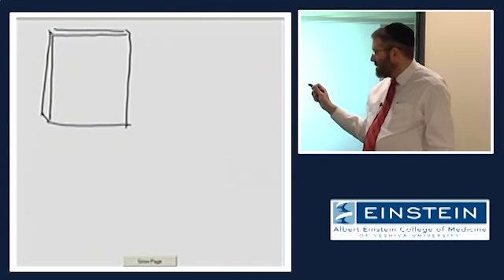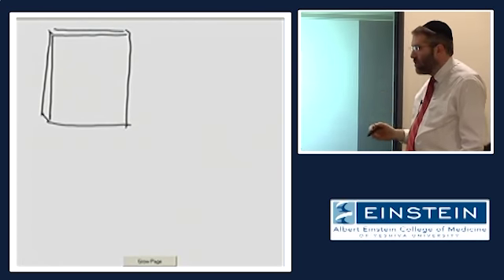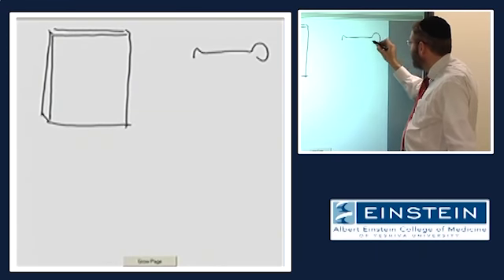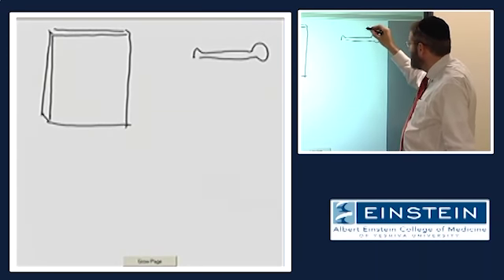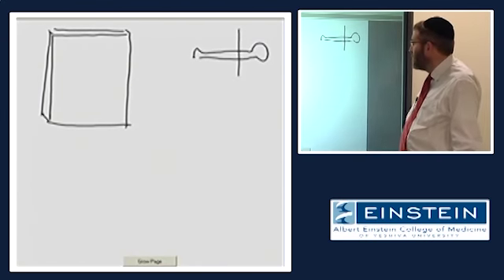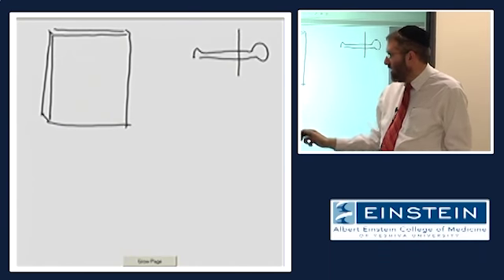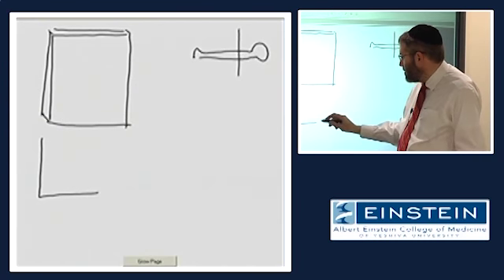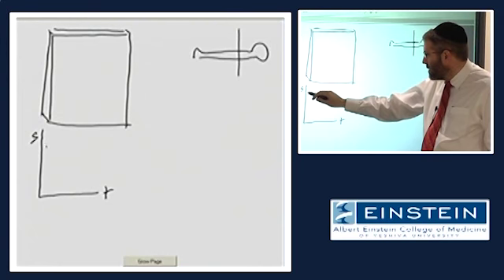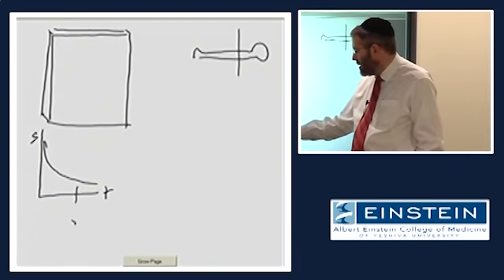But if we measure that signal after using this slice selection gradient, and I go back and ask you the same question, right? The patient is sitting here in the scanner, and we've selected a certain slice, let's say through the chest. So we measure the signal, and I now ask you, here is our signal intensity, transverse magnetization, going away with T2 star, and we measure it at some time TE.